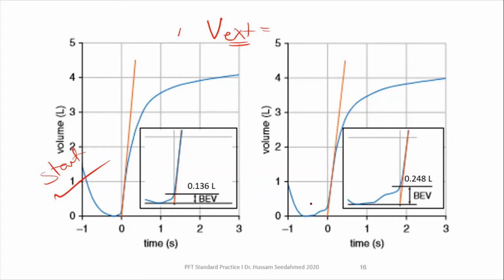This usually is going to affect the FEV1. Sometimes a device calculates it for you from the extrapolated volume. According to the guidelines, for an accurate FEV1 the extrapolated volume should not be greater than 150 ml or 5% of the total FVC. This is the extrapolated volume. There is a manual way that you can measure or calculate the extrapolated volume, but I will not go into it.